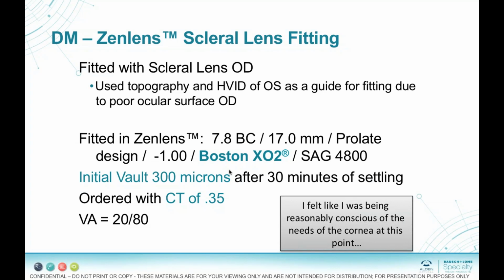Through this initial lens, she was 20/80, and I felt like I was doing the right thing in terms of being conscious of the needs of her cornea at this point. Having fitted many neurotrophic corneas, this was just kind of a standard fit in my opinion.